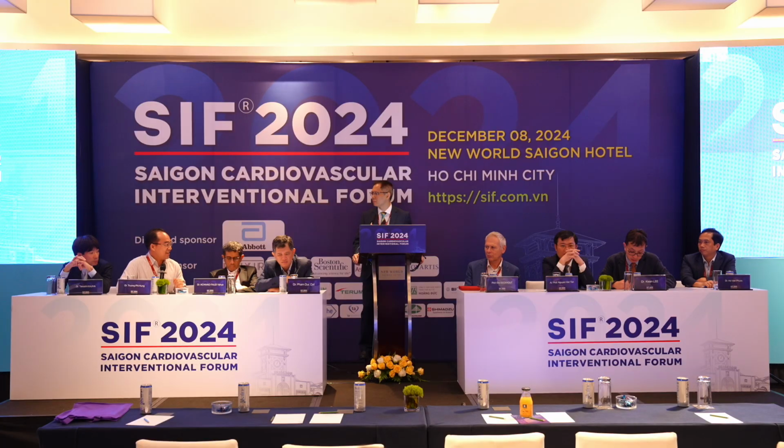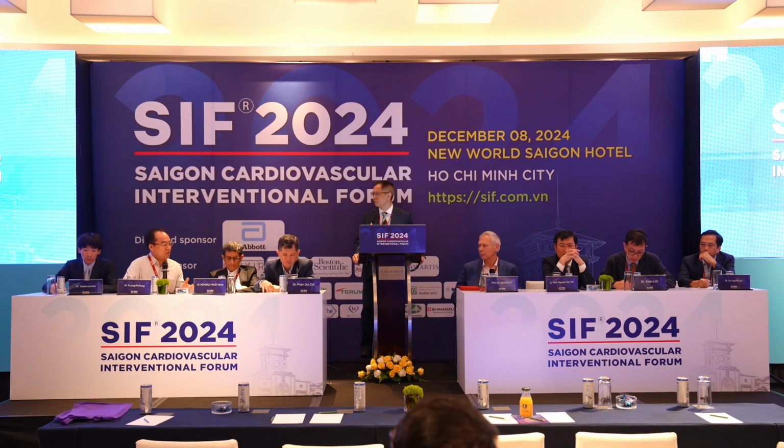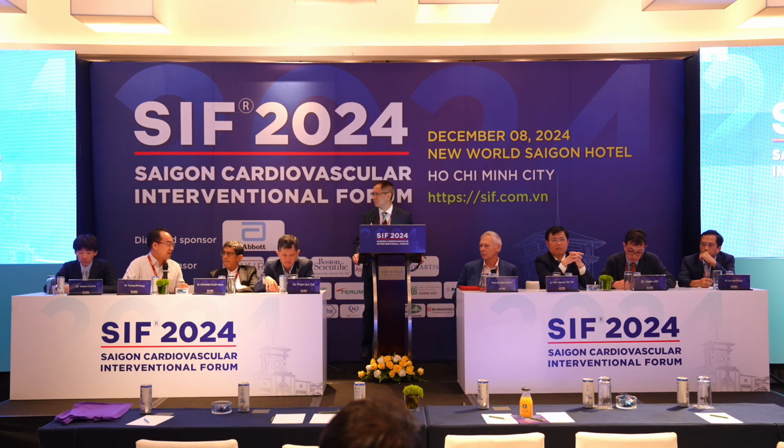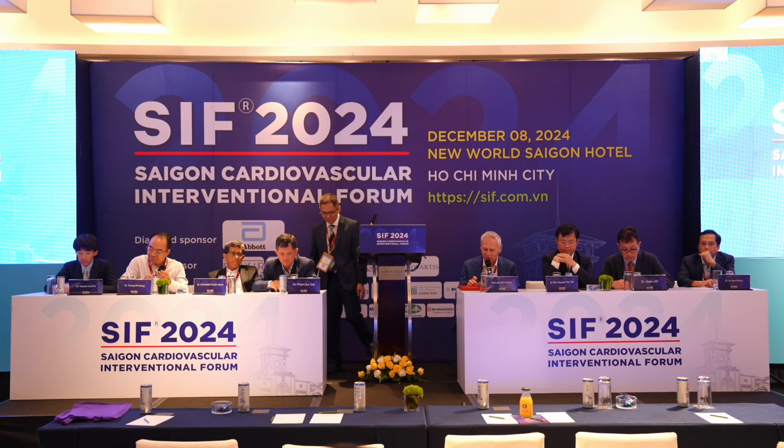Yes, just a little bit like this. And sometimes we also use aspiration, thrombectomy. Sometimes we go ahead with balloon. It depends on the patient. It depends on how large the burden of thrombus is. After that, we make the decision for the patient. I think it's good for the patient now. Yes. Okay, thank you very much. Thank you very much for your nice lecture.